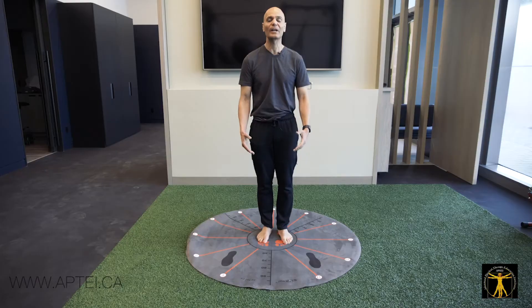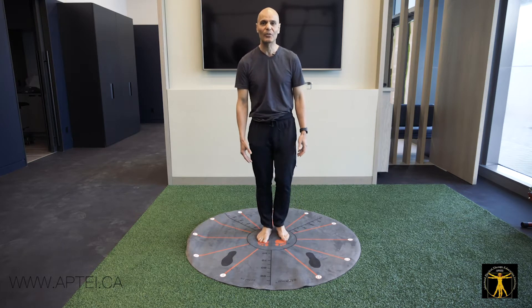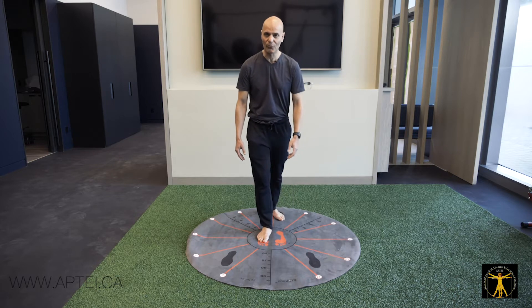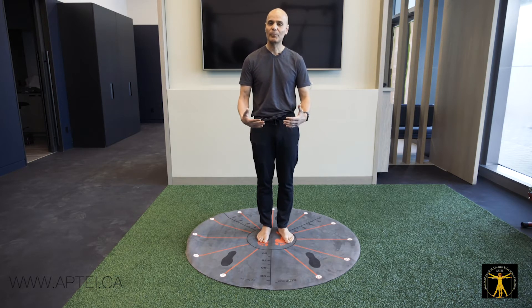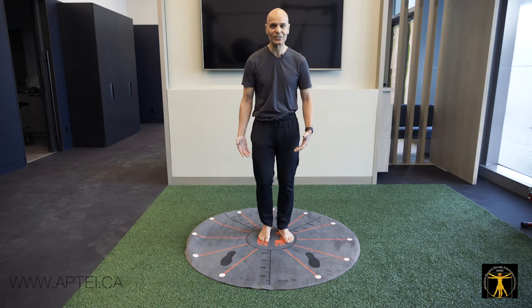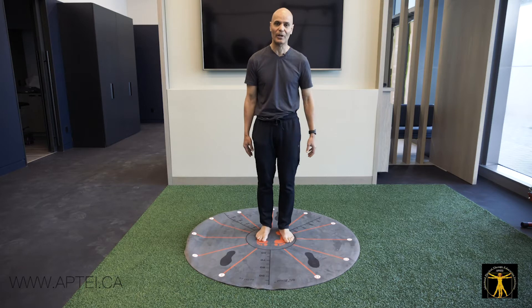I particularly give this to anyone at risk of fall, especially the elderly, so they learn to step to 11 o'clock, 12 o'clock, and counterclockwise with the other leg. When people fall, it's because they weren't able to use their leg. By doing these exercises every day, they're teaching their body that their legs can move in different directions.